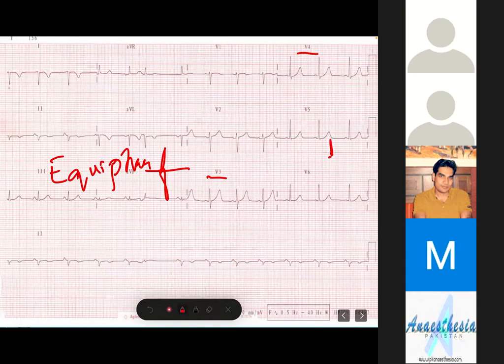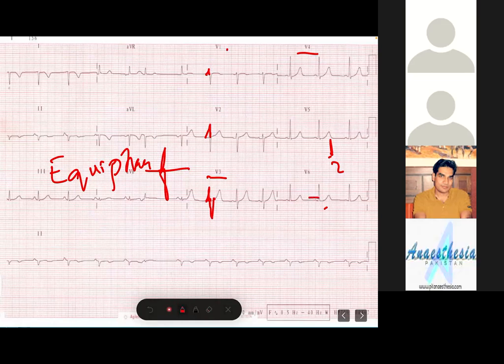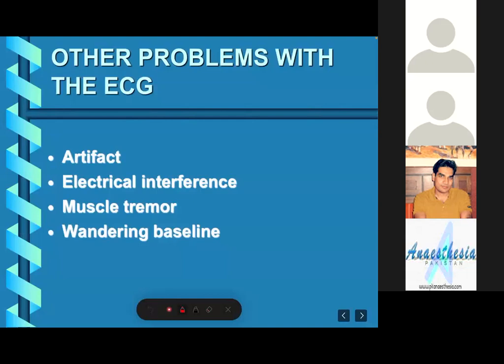In this ECG, there is no poor R wave progression. This upward deflection is the R wave. It normally increases in size from V1 to V6. In V3 and V4, it equals the S wave, and it is tallest in V6 and minimal in V1. The R wave increases in pattern as we go from V1 to V6. This is the normal transition of the R wave.